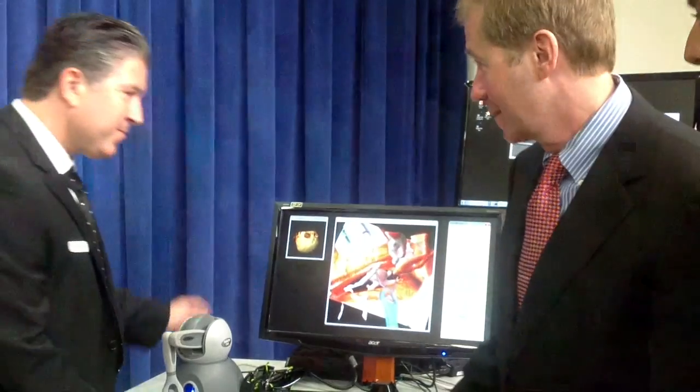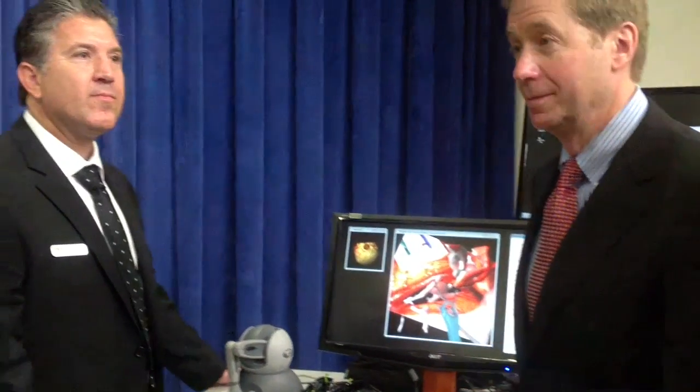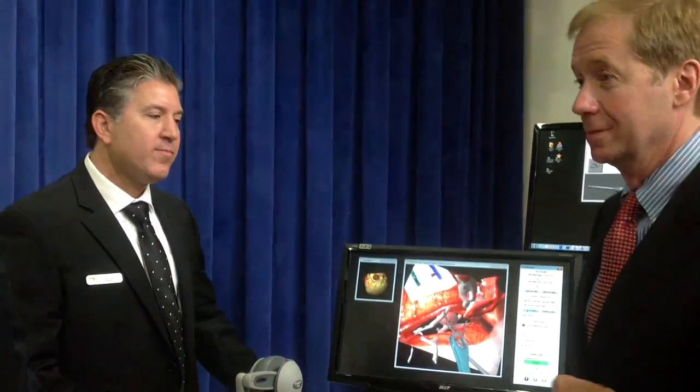Hi, MedGadget. This is Shiv Bhavani. I'm here with the Surgical Theater team. We have Dr. Selman, the motive, the president, and we have Dr. Sloan. And they're going to show us a very cool Surgical Theater application right now. And maybe one of you can describe it while we're seeing the demo.